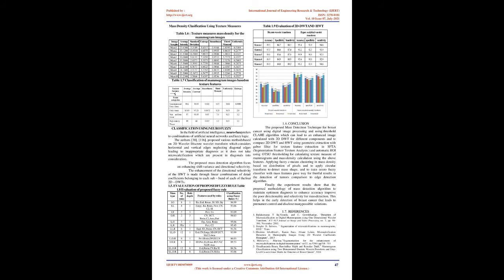The filter bank structure can be iterated in a similar manner on the LL channel to provide multilevel decomposition. The main disadvantages of 2D DWT are the poor directional selectivity and shift sensitivity. Separable filtering along the rows and columns of the image produces four images at each level. The LH and HL bandpass sub-images can select mainly horizontal and vertical edges respectively, but the HH sub-image components come from diagonal features of either orientation.